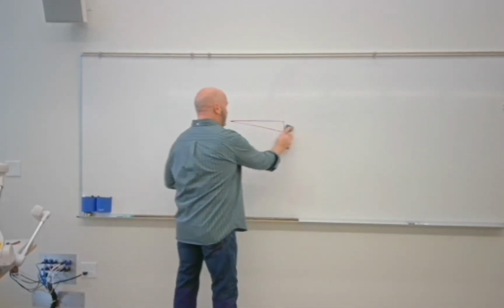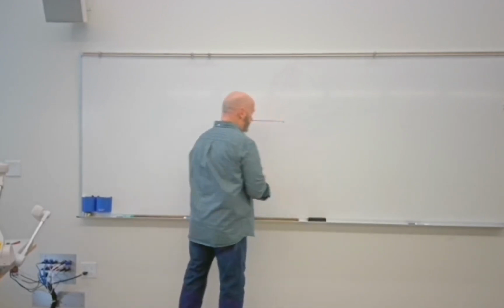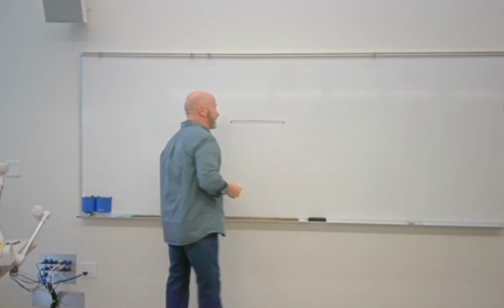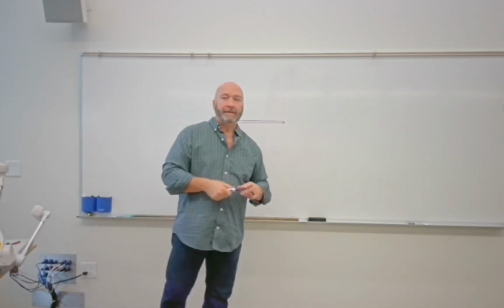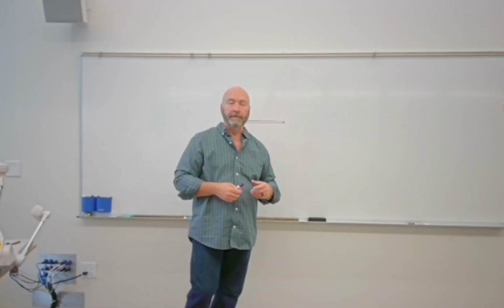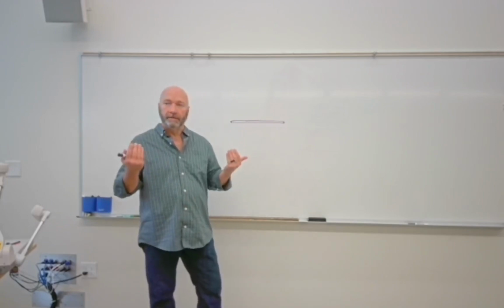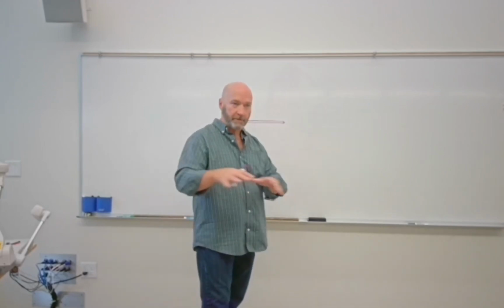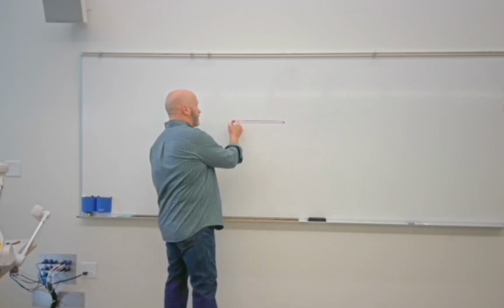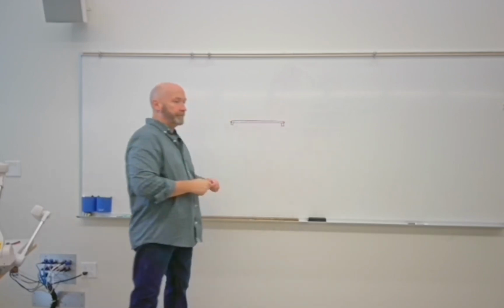So making this more uniform thickness, what you've also got are a couple of different orientations for your table. Okay, so you've got relative uniform thickness there, but the carbon fiber and especially the plastic is not going to be sturdy enough, and it needs some sort of support. Right? We talked about the floating tabletop. So we have to have something holding that up into the apparatus so that we can move the tabletop. Floating tabletop, motor driven tabletop. So what you're going to have is metal support. And a lot of times that metal support is on the bottom of the table. And that's good.